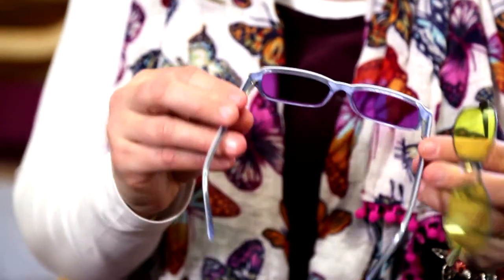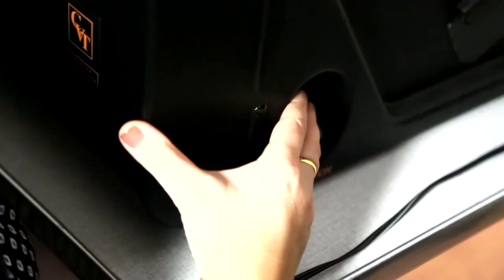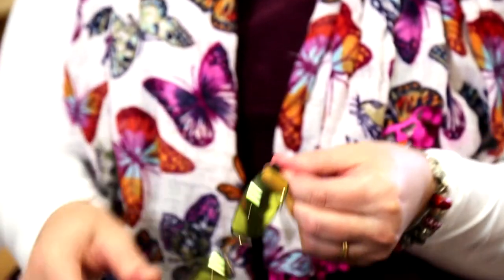First of all you ask them to look at the print and you show them a colour, asking if the print is clearer or more still with the colour or without the colour. And you go round the colour wheel, then change the setting so they can control the saturation and the depth of colour. You can examine a lot of people and find that their reading experience will improve if you give them the colour that is most appropriate to them.